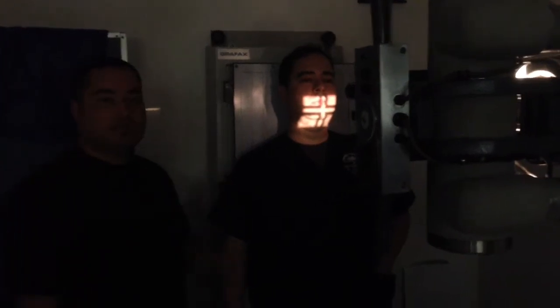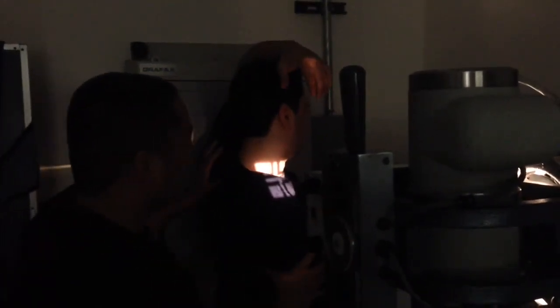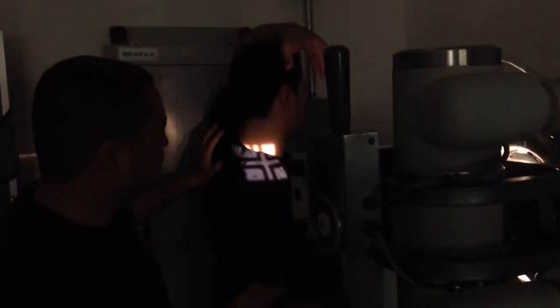So that's your open mouth. Then we're going to do a swimmer's. Go ahead and turn towards the wall. Your left arm up, over your head. You want as close as possible to the film when you do this. Drop your shoulder. This is C7-T1, right? So stay right there. What is C7-T1?